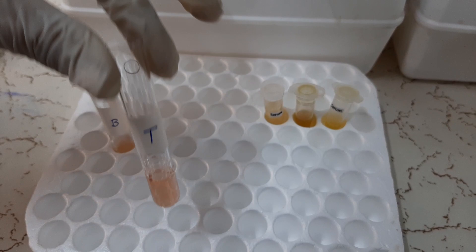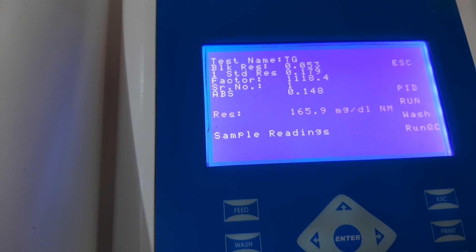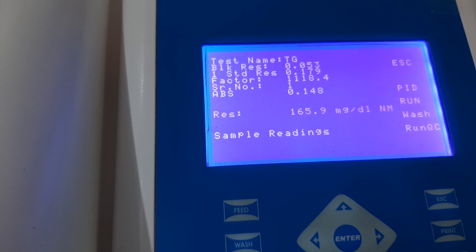Now the instrument gives the message to read the sample. We will take our third tube of the test and aspirate the reaction mixture into the flow cell. After a small lag time, the instrument will calculate the absorbance and the result of the patient sample. If you wish to run more patient samples, follow the exact same procedure. This is the correct way to perform a triglyceride test. Thank you, and we hope this video has been helpful for you.